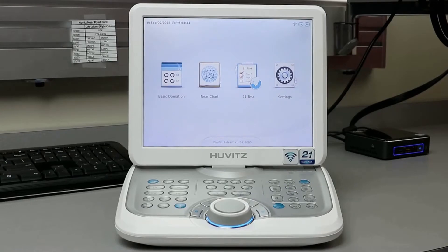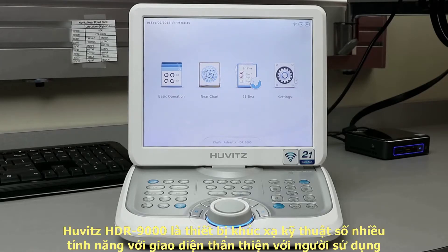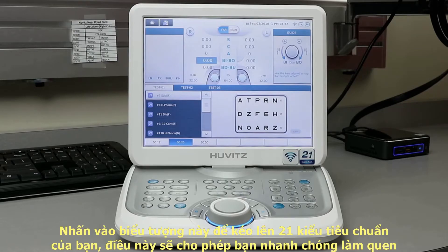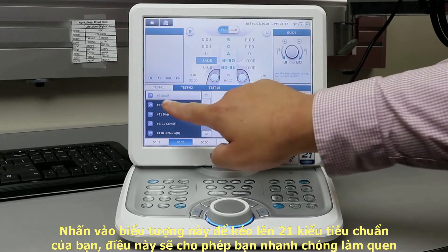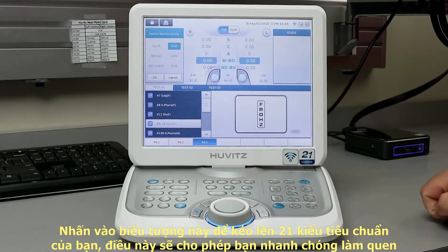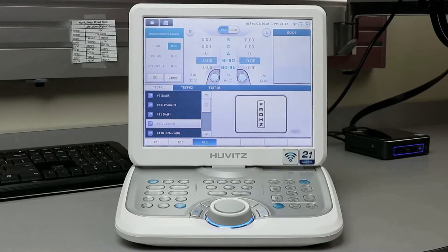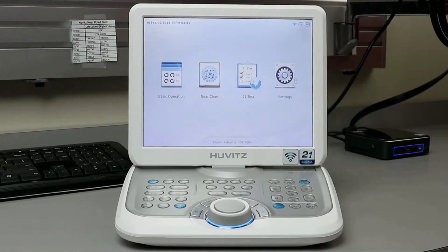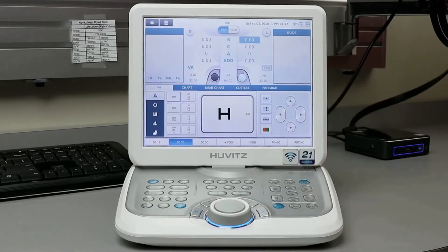The Huvitz HDR 9000 is a feature-rich digital refractor with a user-friendly interface. Here at the home menu, you will see the 21 test icon. Press this icon to pull up 21 of your standard charts, which will allow you to quickly complete a full examination. Press the home icon to return to the main menu, then go to basic operation — this is where you will do a majority of the testing.